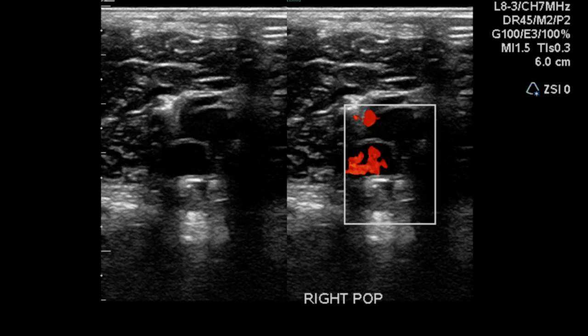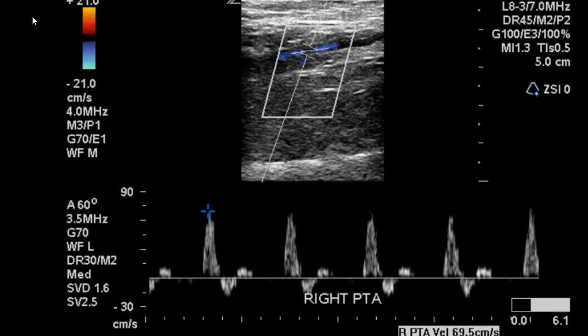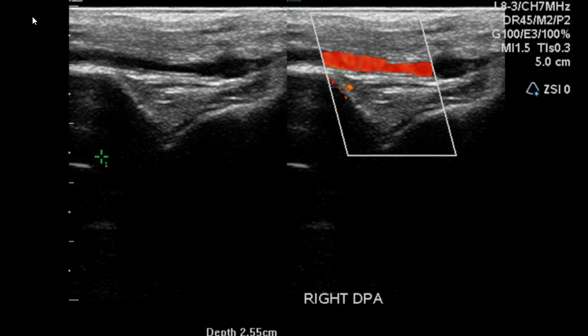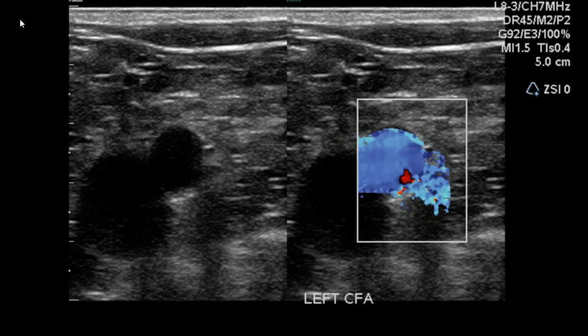This is important because segmentally we want to determine if there are any areas of stenosis, and this process is continued through to the ankle.